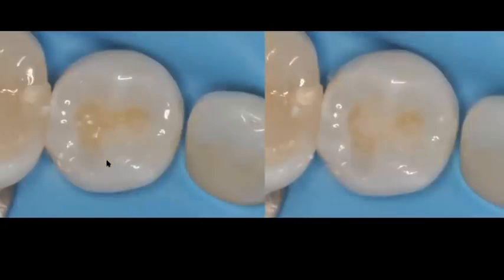I'm now working on my successive cusp buildup technique, and I'm starting on this mesial lingual cusp. You can see that I'm trying to stay away from the distal lingual so that I can recreate this little groove that should go in between these two cusps. So I'm going right here. You can see I have my distal lingual. Now I'm doing my buccal cusp. And you can see that when these successive cusp buildup increments come together, I am recreating here a groove.